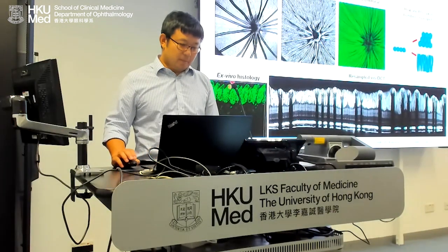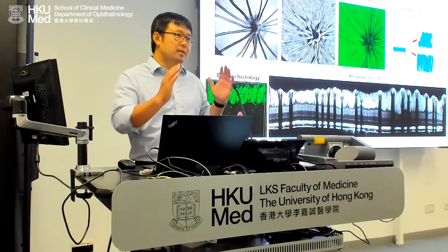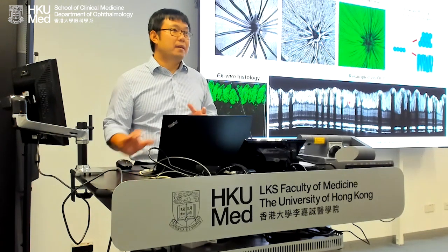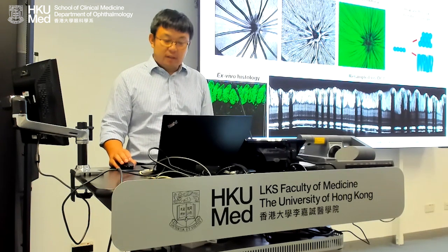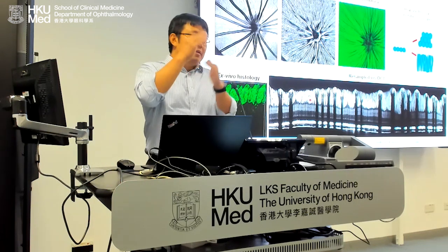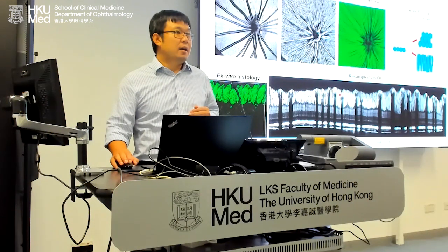So this is the histology from just one cross-section from here. And this is actually the OCT. So the histology shows that the fibers push against each other and become elongated. And the OCT shows the same, they become elongated. Also, if you look at these fibers carefully, so these are RFL. They're actually 2 layers, right? So there's a bottom layer and there's a top layer.